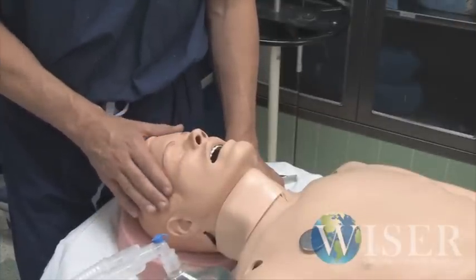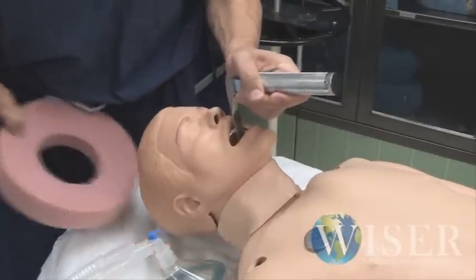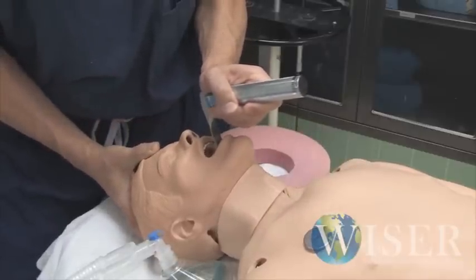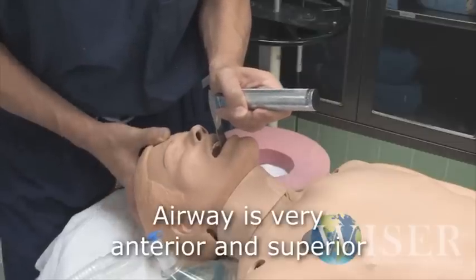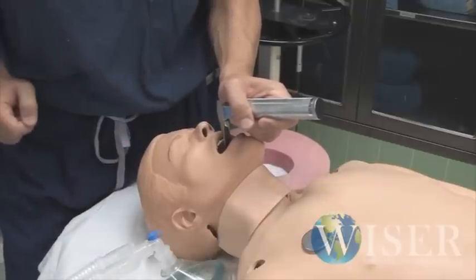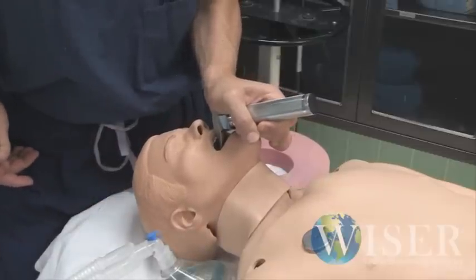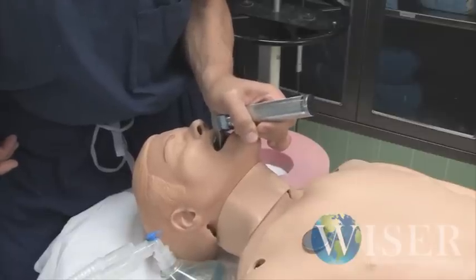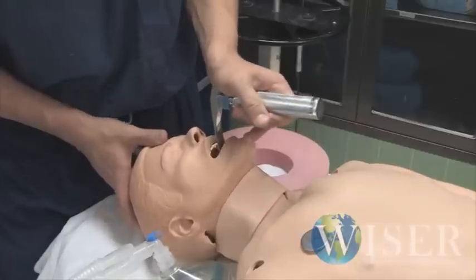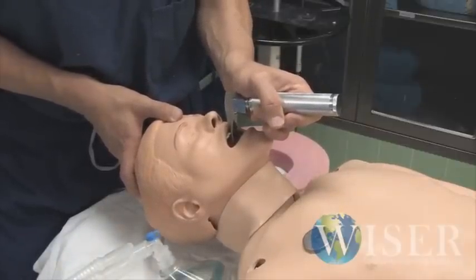For some of the nuances of direct laryngoscopy on this simulator: number one, his neck is very, very stiff. So when you do direct laryngoscopy and get in the right position and lift up, oftentimes the whole head will come up with it, and a confederate may help you extend his neck to give you a better view. This mannequin has a very anterior and superior airway. I can always tell when medical students are intubating inappropriately when they've got a lot of blade inside the mouth — usually that means they're using the MAC blade like a Miller blade, picking up the epiglottis instead of being in the vallecula. With this mannequin you can still sometimes get a view, but the tube will tend to slide into the esophagus. Look for the epiglottis and be aware it's going to be a little more superior and anterior than you're used to. Overall, the mannequins are not too difficult to do direct laryngoscopy and endotracheal intubation on.